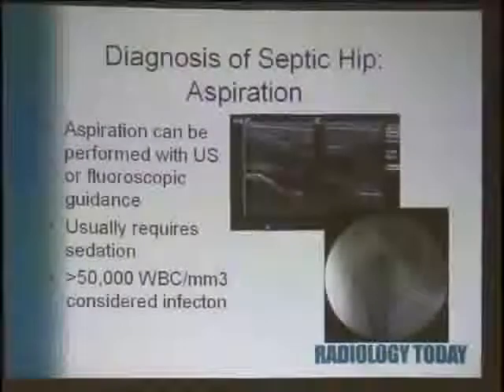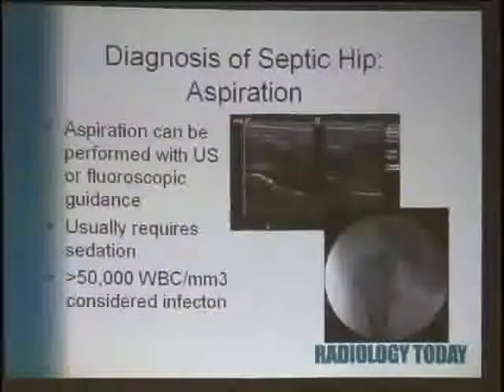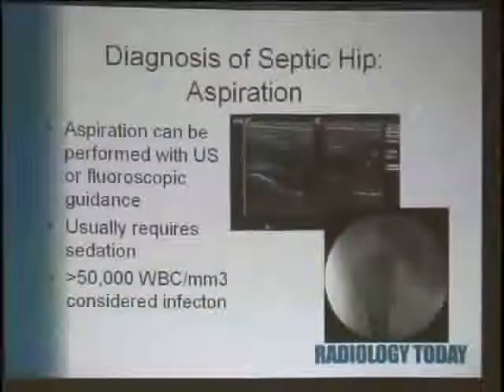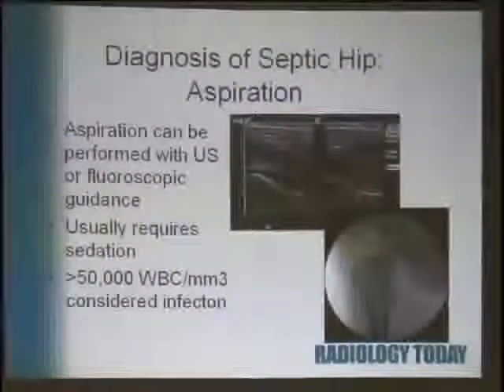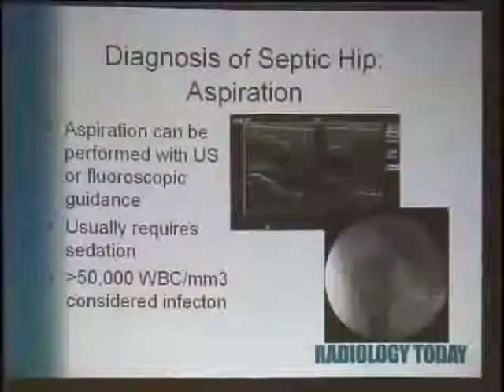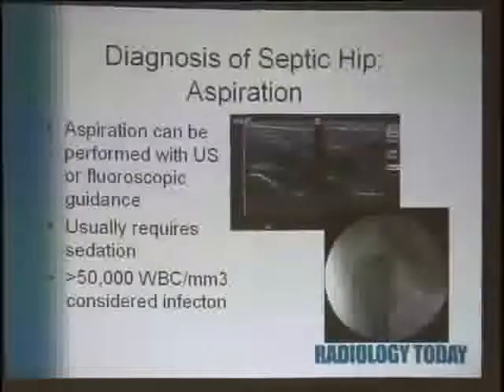Okay, go forward. And then what we can help with next is one of the times we can actually help with treatment. We can do an aspiration. It used to be done fluoroscopically, and here you see a needle being put under fluoroscopic guidance into the joint space. We much prefer to do children and anybody really under ultrasound. Here's where you see this big fluid collection. Our interventional radiologists do these, Sue being one of them. You take a little needle and come right directly down into the space. We can do it in the ultrasound room, give them conscious sedation, and get it done and send it off and then see if they have an infection.